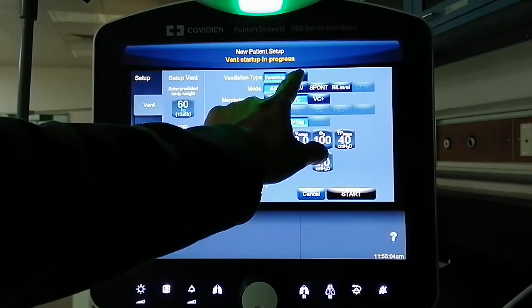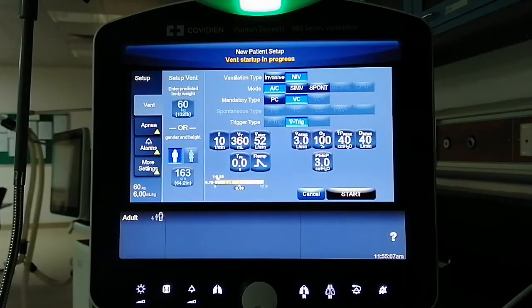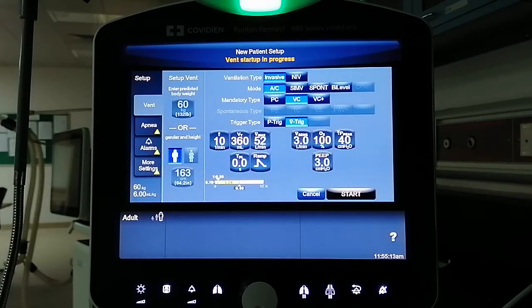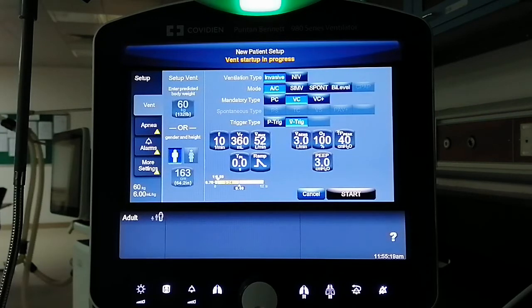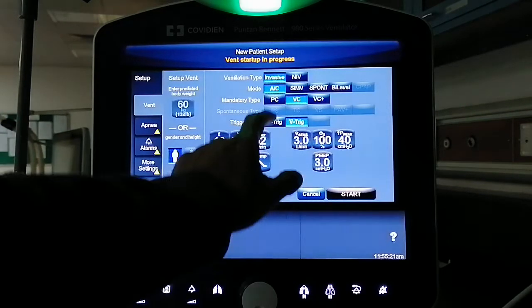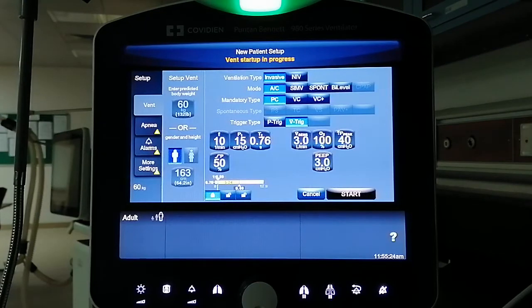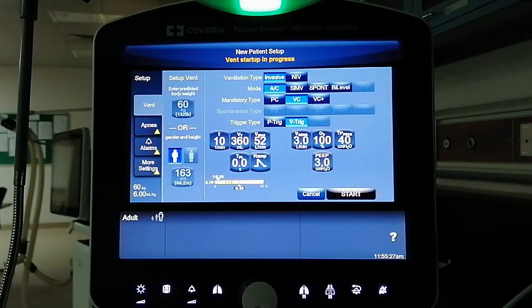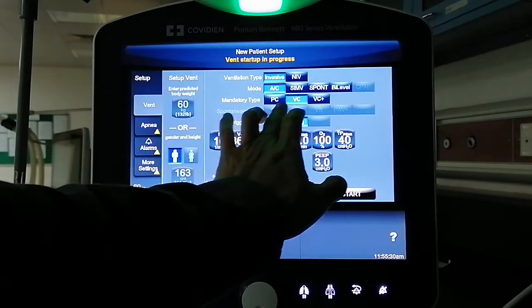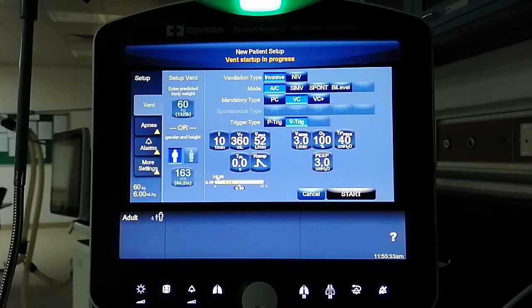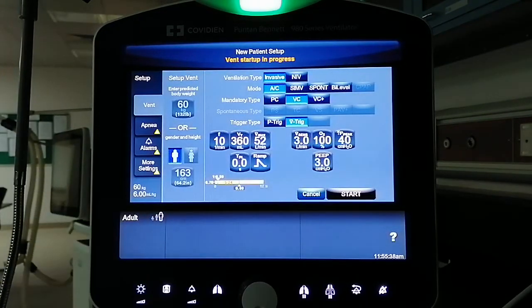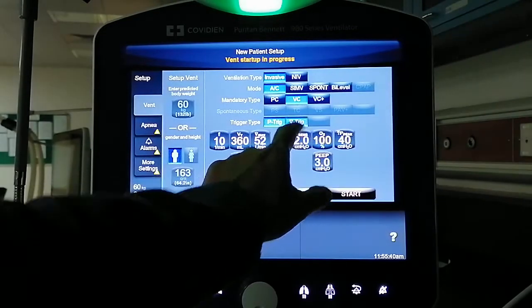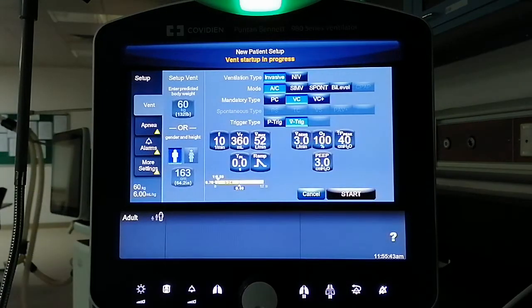When switching between invasive or non-invasive, you can see right away the changes in the set parameters. Let's say invasive — we are going to select AC or assist control, and in the mandatory type we select volume control. There is no spontaneous type because the mode selected is assist control. Then we can select which trigger we want: pressure triggering or flow triggering. In this case, let's select flow triggering.